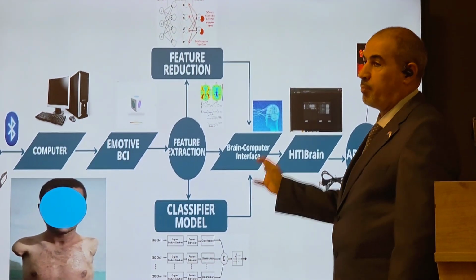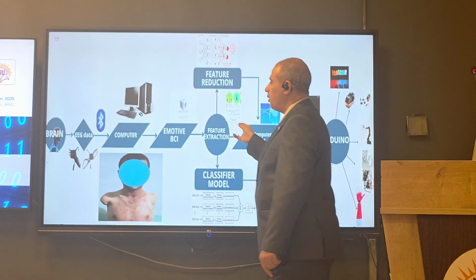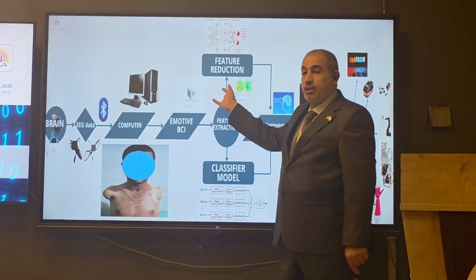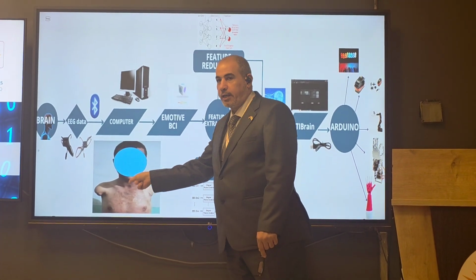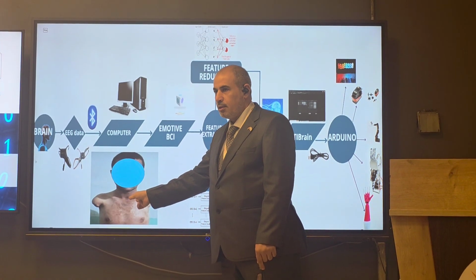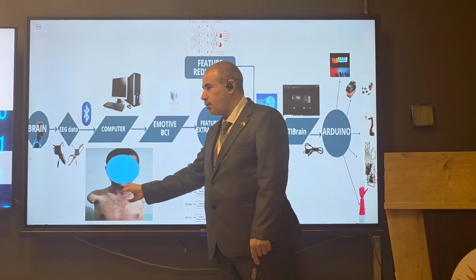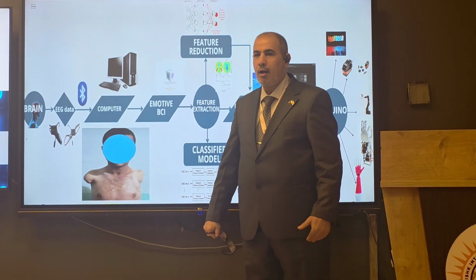This same project, just with EEG signal, is more complex. This flowchart is for the process for all the project. Brain, EEG signal, data, computer. Why use EEG signal? This is the big problem statement. Now, this real case in Ramadi city: a young man, 17 years old, explosion from the electrical transformer, therefore lost two upper limbs and two lower limbs.